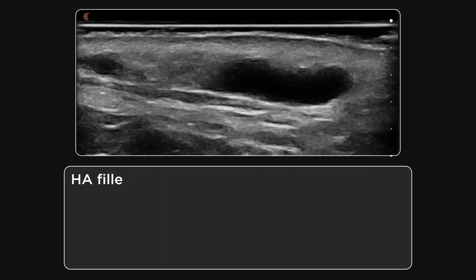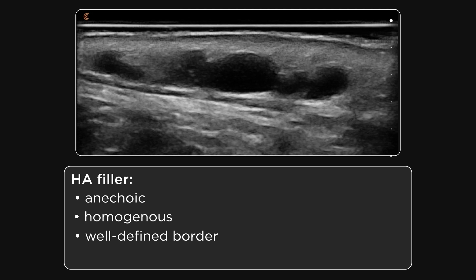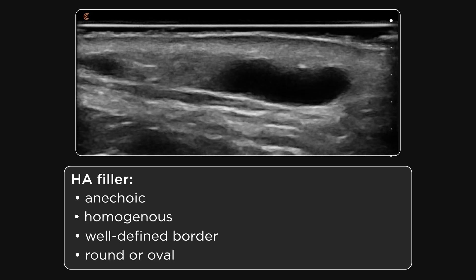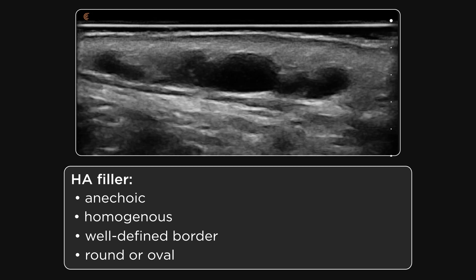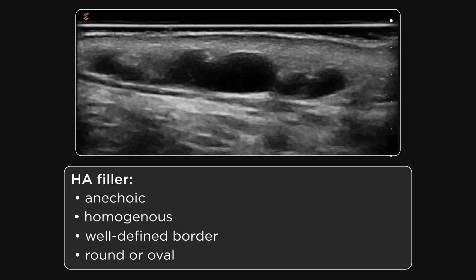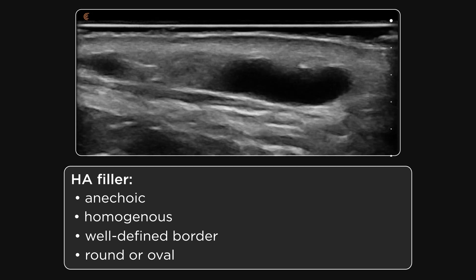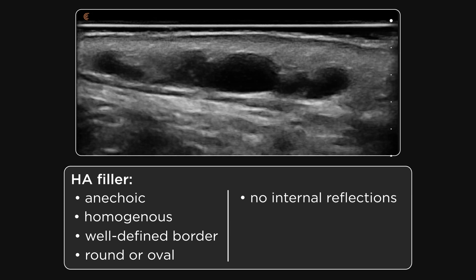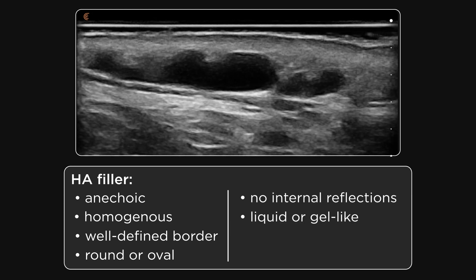This is HA. It is anechoic and homogeneous with a well-defined border. HA is usually round or oval in shape. The diameter varies according to the size of the deposit placed, but generally per deposit we expect less than 0.5 ml given the size of syringes available on the market. There are no internal reflections, and this tells us the product is liquid or gel-like.